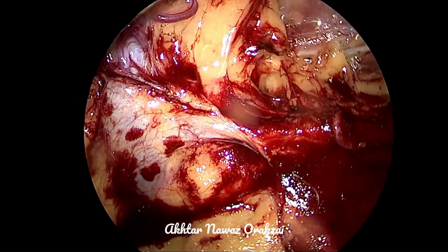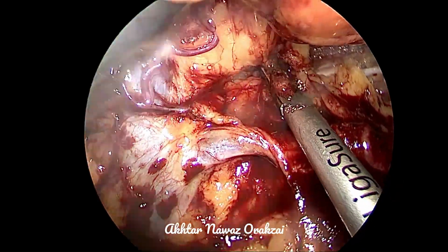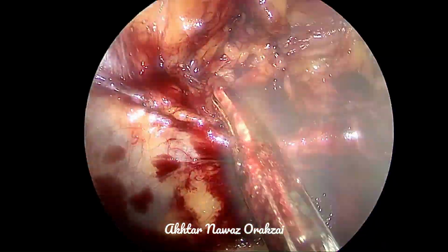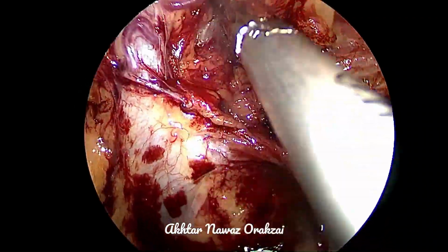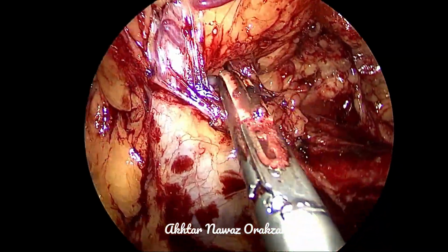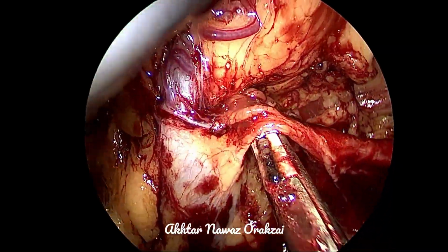Here we are going to see another video of the radical nephrectomy of the left side. Same is the case here. This is another 65 years old non-hypertensive and normoglycemic lady who is having around 6.5-7 centimeter mass in the lower pole.